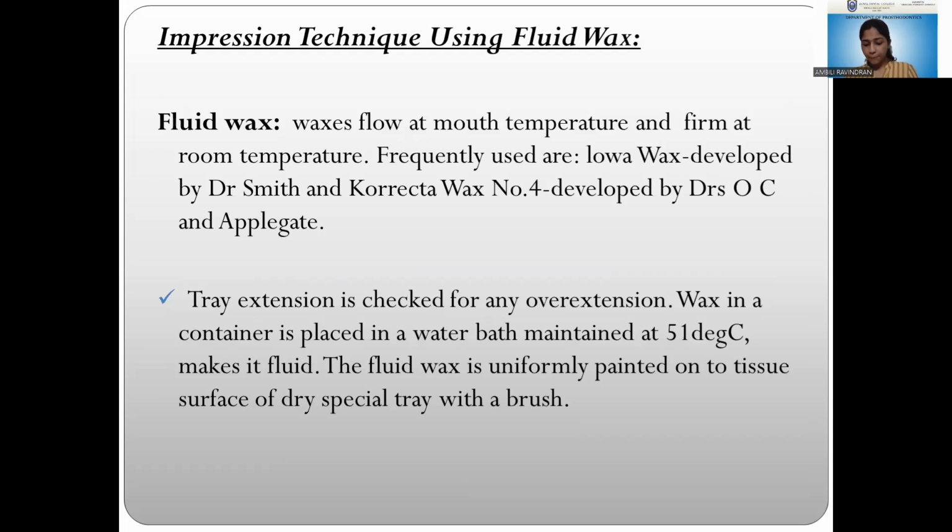Now coming to the impression technique using fluid wax. What is a fluid wax? It's a wax that will flow at mouth temperature, and it will be rigid at room temperature.